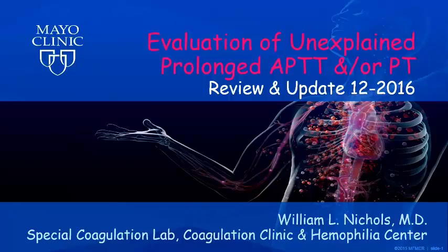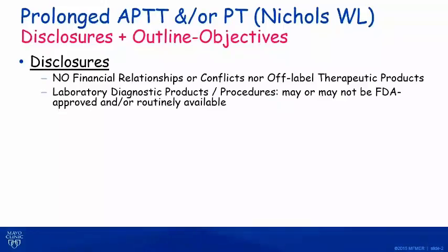Okay, we're going to start off with prolonged clotting time profile testing. This is designed to deal with unexplained prolonged clotting time test results that need further evaluation.